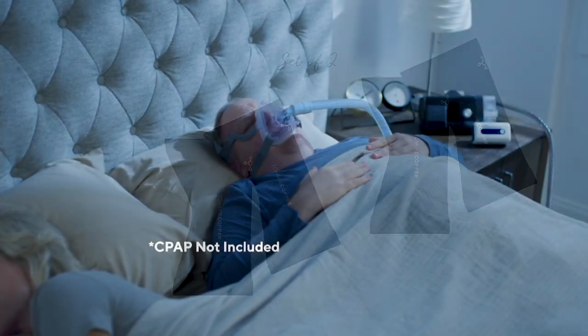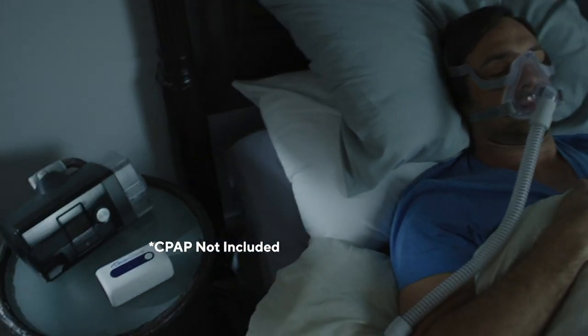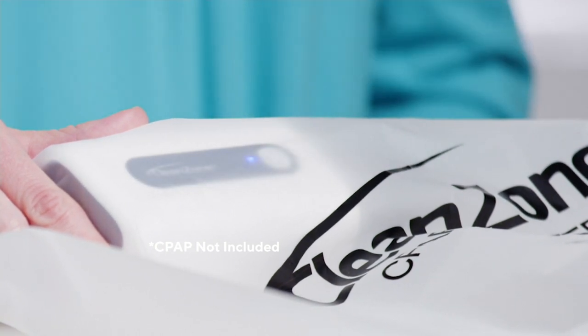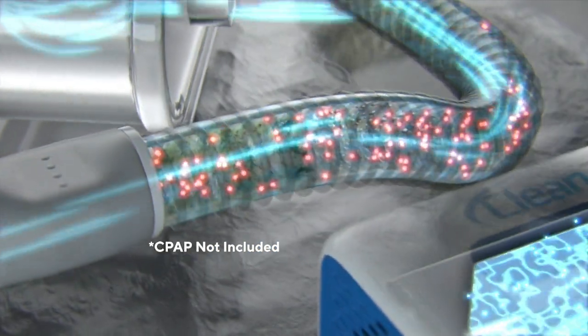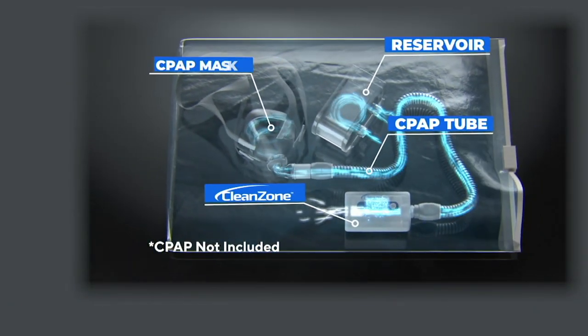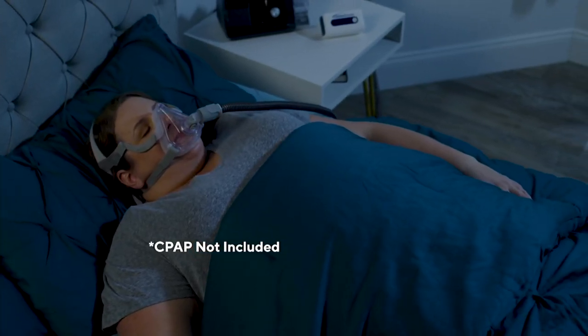Let's talk about this product here — my pick of the show. It's called the Clean Zone CPAP Cleaner and Sanitizer, with 62 cleaning wipes as well. This has just been back in stock. The last time we had it, it sold out on In the Kitchen with David, or Down Home with David. It went so quickly, and we brought it back for you.